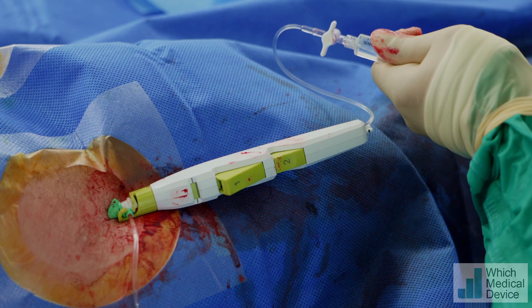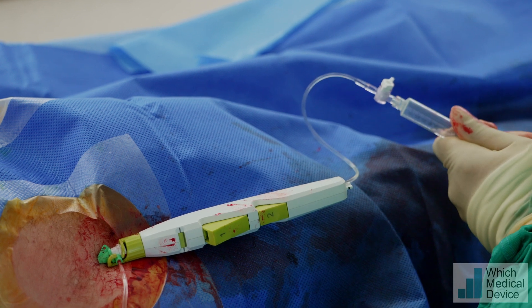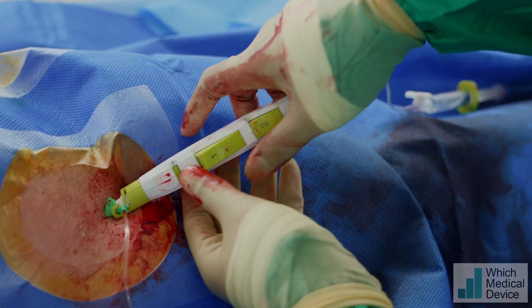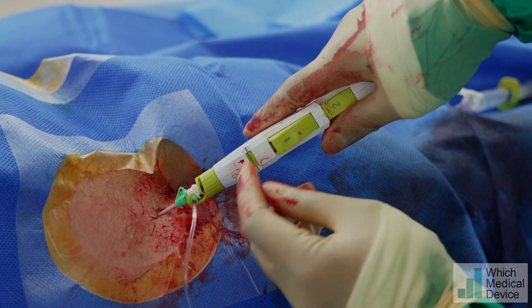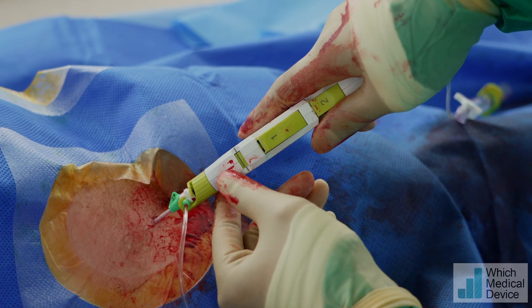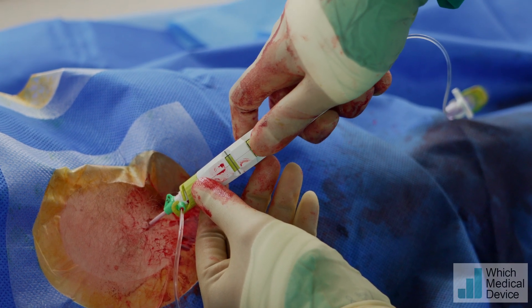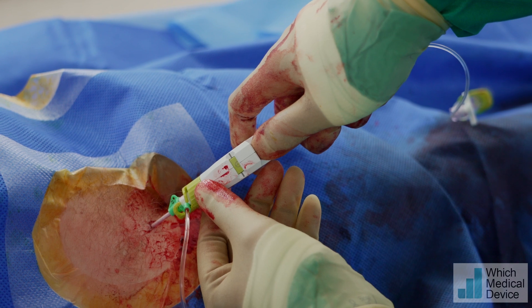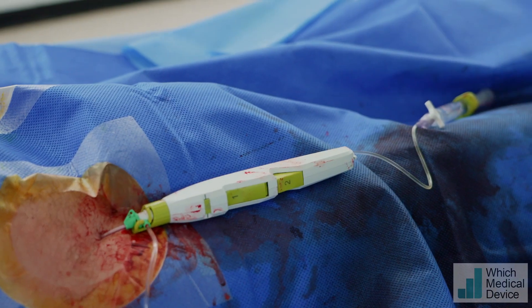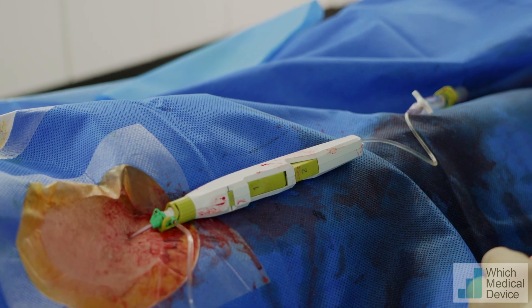I pull that back a bit — we've got it on lock. So the balloon is inflated inside the vessel and I'm just going to pull this out. The ratchet will push the sheath back, and now you can see the bar is right in between those two lines. At this point we've got maximum tension — that's where the balloon is. Press number one, and that deploys the polyethylene glycol on top of the vessel. At this point we can relax and wait for two minutes. After two minutes, I'll deflate the balloon and press number two to capture the device and remove it.